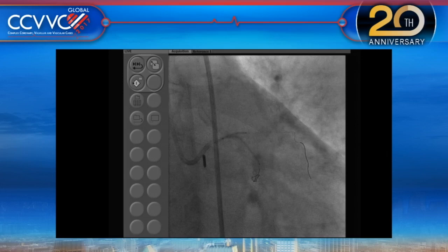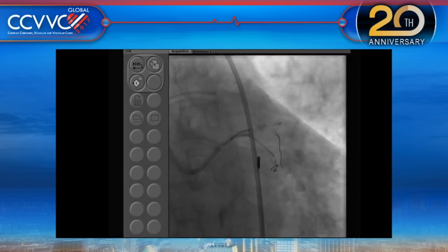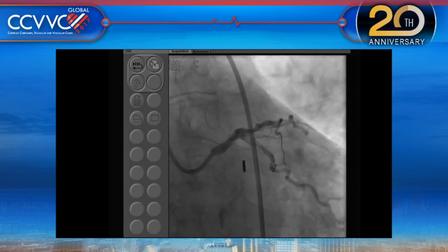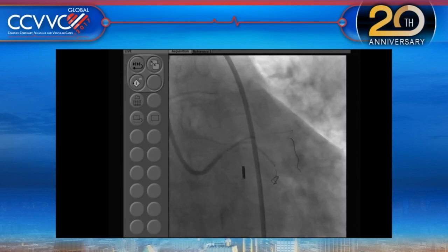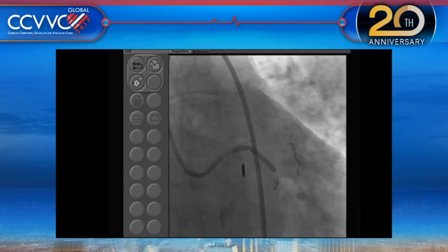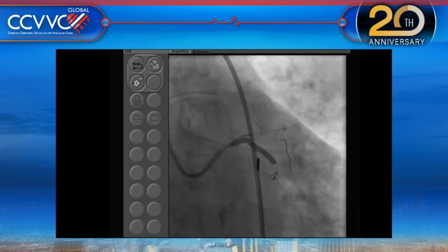Fluoro. Yeah. Good, ready? You want to go? Okay, good. So let's show us this, and then I'll tell you about our timing here. Okay. This is a circ. I'm deploying the circ now. We are going to take the circ wire out after the deployment, and you'll need a new wire. This wire has done its job. 16. Down. Go up again.